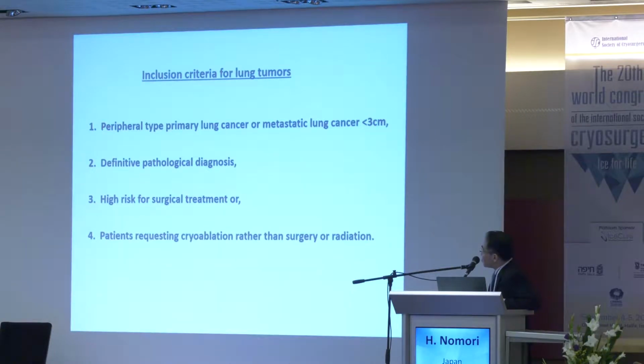The slide shows the inclusion criteria for lung tumors. Peripheral type primary lung cancer or metastatic lung cancer, less than 3 centimeters. Definitive pathological diagnosis by CT guide needle biopsy. And third, high risk for surgical treatment or patient requesting cryoablation rather than surgery or radiation.